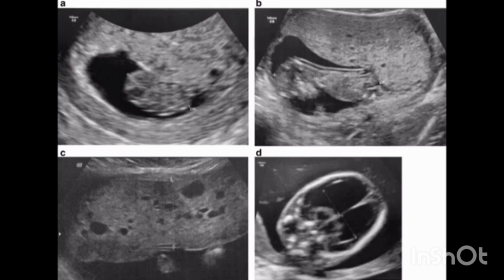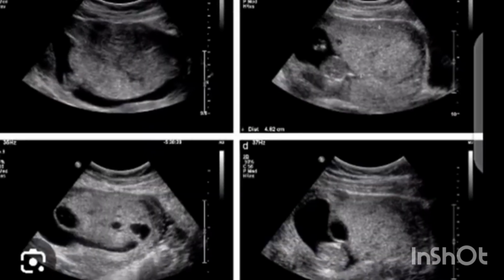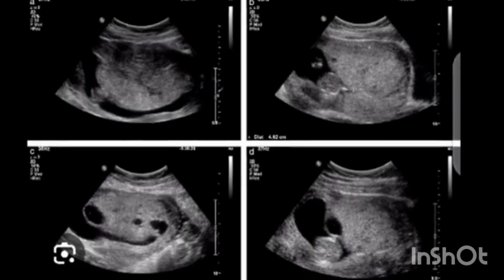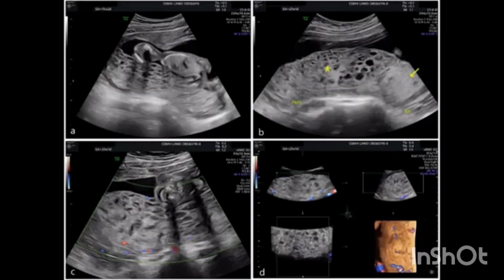On ultrasound, definitive diagnosis is often difficult. Described sonographic features include: 1. Greatly enlarged placenta relative to the size of the uterine cavity. 2. Cystic spaces within the placenta, molar placenta, which may not always be present.